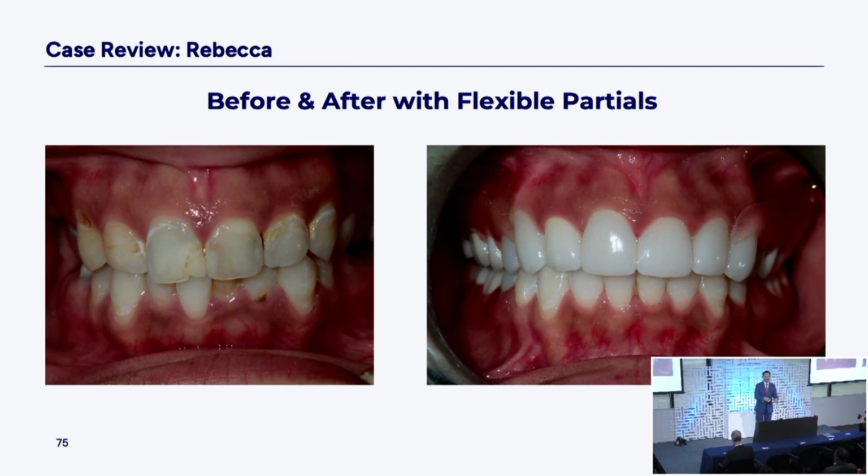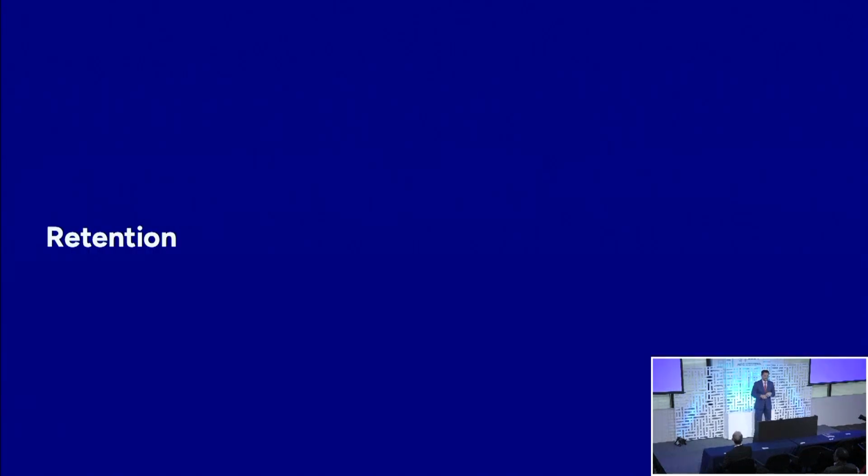But meanwhile, the clear aligners play a significant role in shaping that arch, because you were able to separate the lower teeth out where they belong, which changes where your upper teeth are, changes your bite and your arch form and width. You have a really nice solution, and the clear aligners are a part of it. So don't discount the clear aligner section of your treatment. It's nice to do the alignment before the final crowns, because once you get those lower teeth and you send in your scans for those crowns here, they're going to be gorgeous. It's going to be nice.